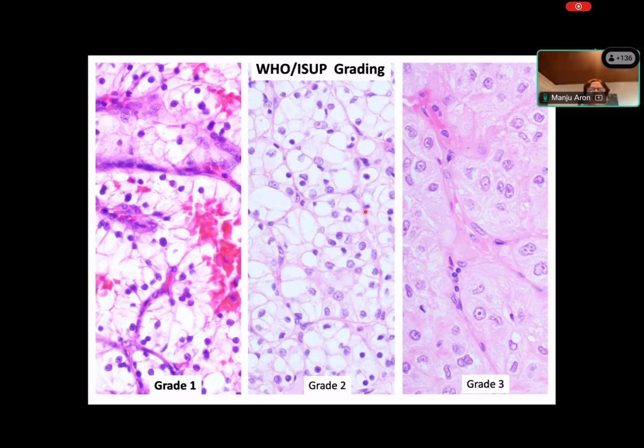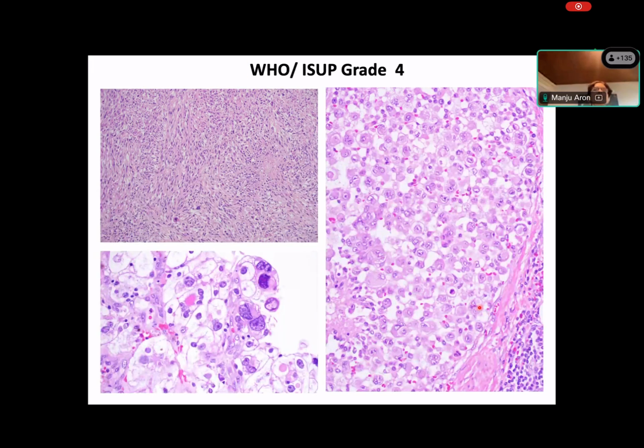Most of these tumors are grade 2, but some can be grade 1, and of course the high-grade tumors are grade 3. If you have sarcomatoid differentiation or rhabdoid differentiation, then it is a grade 4 tumor. You can also have tumors with tumor giant cells, and when they are present, you grade the tumor as grade 4. Grade heterogeneity is a feature of renal cell carcinomas, so you have to sample adequately, look at the gross, and target areas where you think there could be sarcomatoid areas. If you see higher grade areas in even one high power field, that will determine the grade of the tumor.